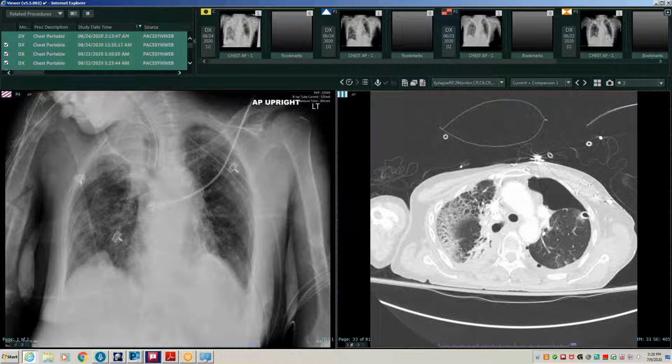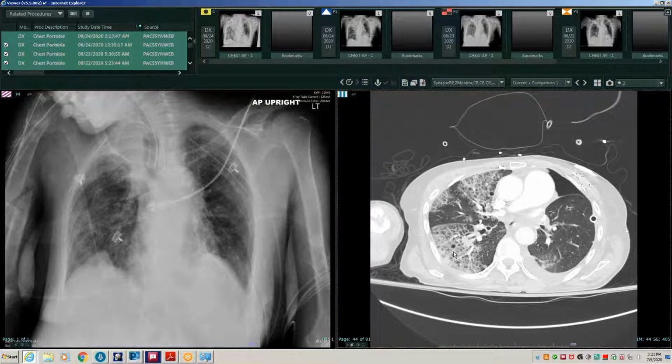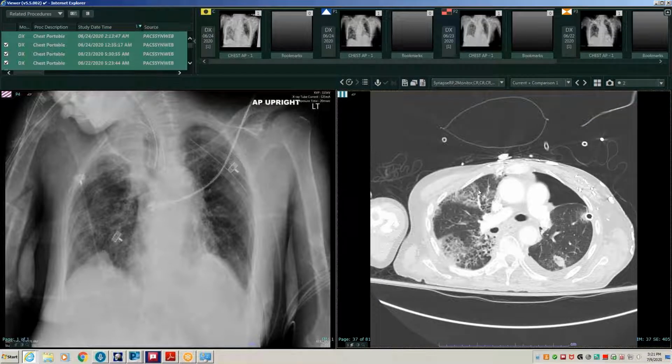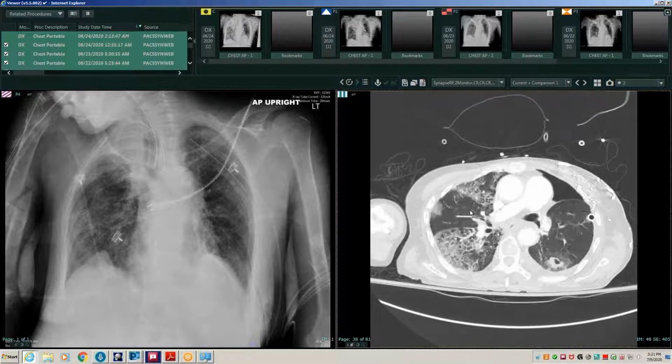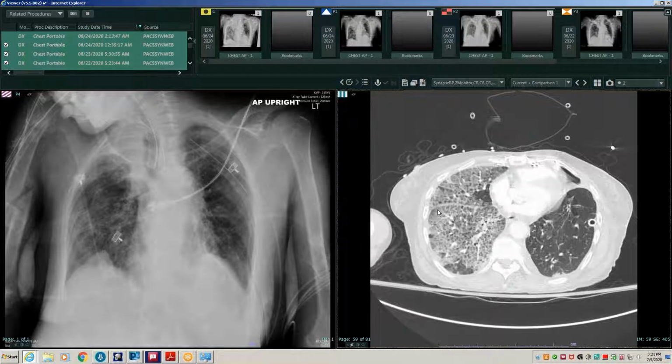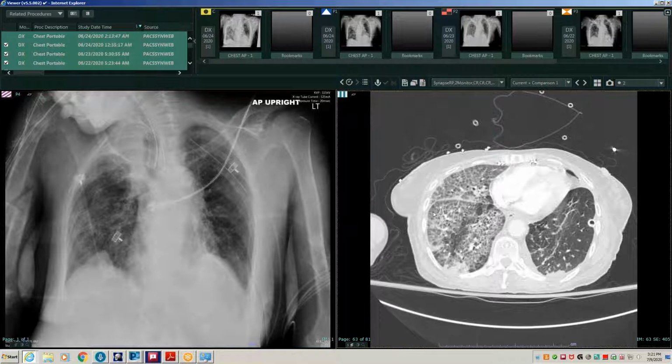Another reason for doubting hydrostatic edema is that there's not any accompanying pleural effusion, or at least not very much that I can see. Right, exactly. I thought that went against edema as well. And there's relatively normal lung, which doesn't really go with diffuse edema, to have such really normal lung here and then these areas of really diffuse ground glass opacity. I think the thing I'm most suspicious of is fat embolism to the downside, given that they manipulated that arm to put her into the downside and stuff like that.